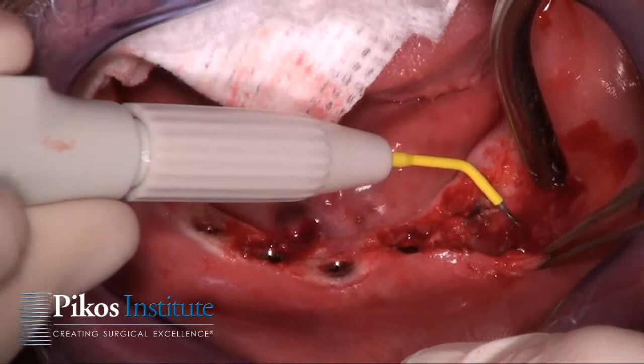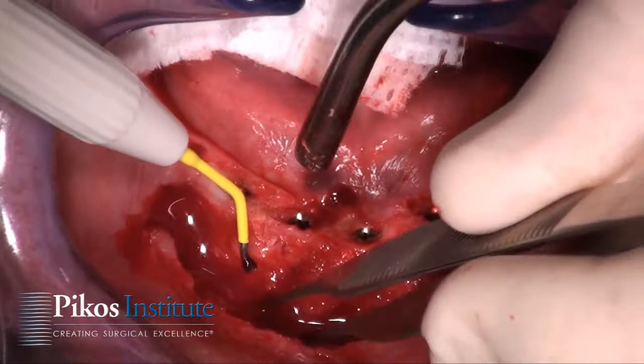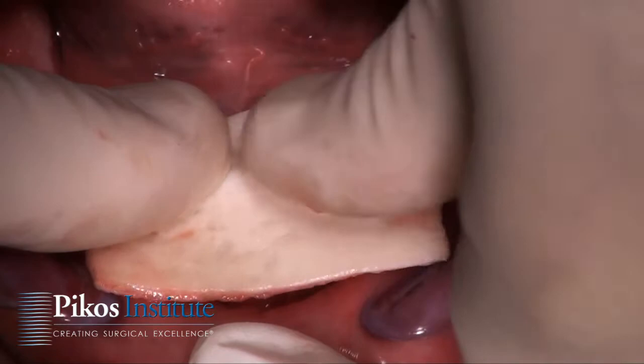It's a supra-periosteal dissection, split thickness, keeping in mind our neurovascular bundle is distal to each of these implants by about five millimeters. Then I'm going to literally push down with my fingers, or in this case my thumbs.